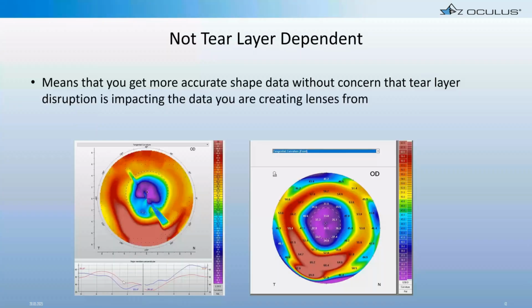One other quality of the Pentacam that I think really makes a big difference. As we transitioned from using our keratograph, for example, to do a lot of our lens design to the Pentacam a few years back, getting full corneal data was really an important factor. We would get better peripheral curves, better edge clearances, and better data in the extreme periphery of our lenses using the Pentacam than we used to with just placido disc topography.